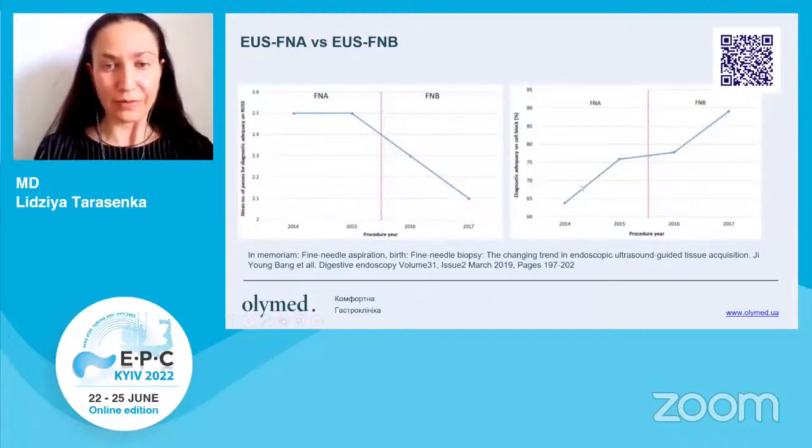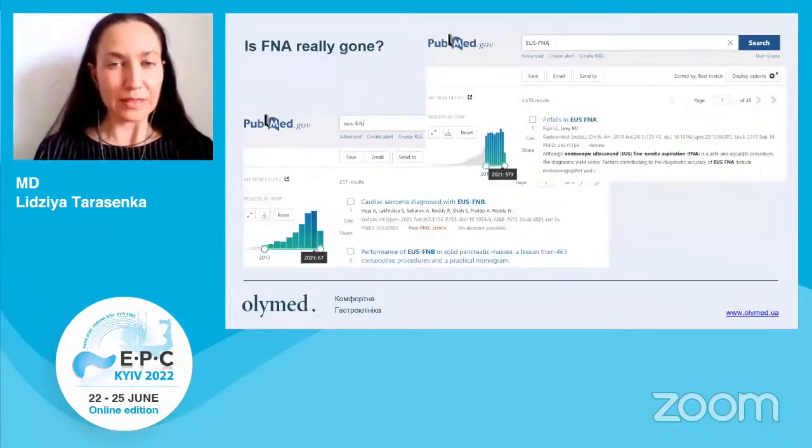To be fair, even with FNA needles, adequacy of samples was growing because not only the needle design is important for obtaining biopsy, but also the experience of the endoscopist. The name of that study was FNA in memoriam, FNB birth, giving us a hint that FNA is no longer needed.